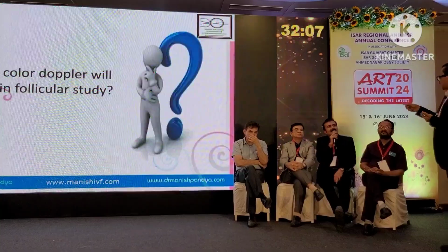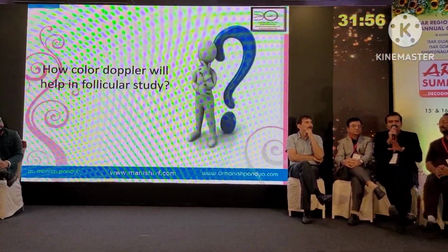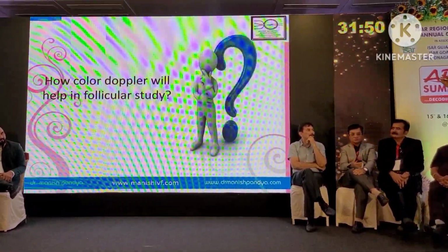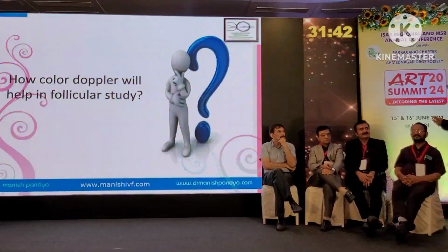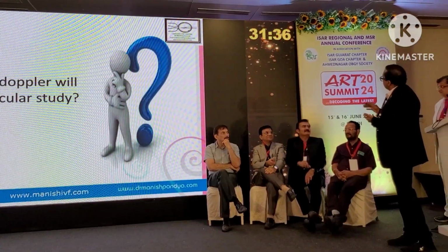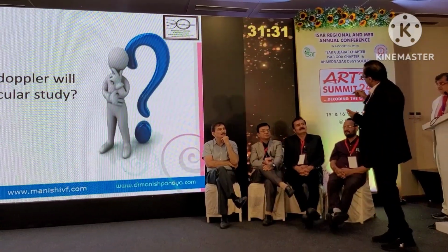If you want to increase the vascularity, you can use so many drugs. But the thing is that Doppler in infertility has no clear-cut guidelines or reliability. That's why I said that color Doppler will help. If you are not seeing good vascularity, there are things with which we can increase the vascularity. Sildenafil has got very good roles. You can give it for 2-3 days, from day 2 only, sildenafil with estradiol. If you know this patient is not having good vascularity, but on day 14 you see like this and you want to increase the vascularity, you have got the whole window.